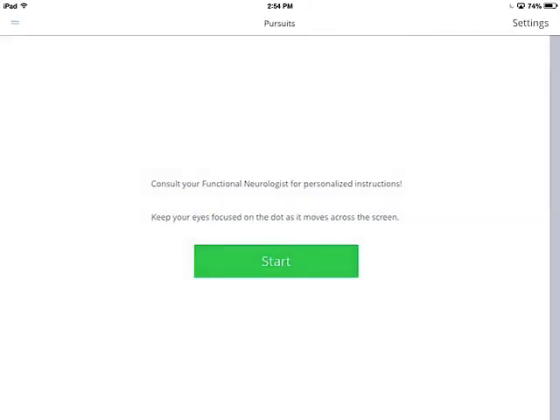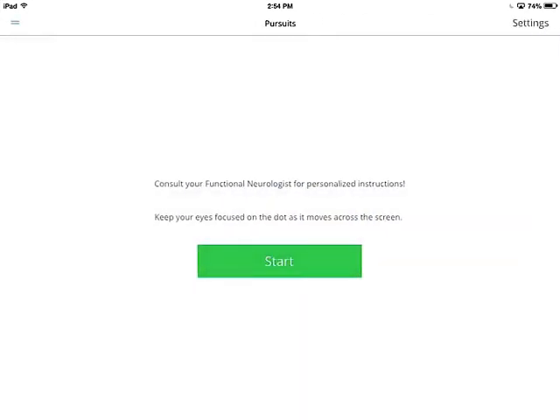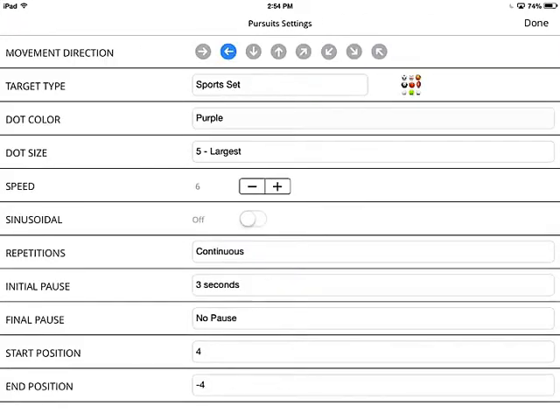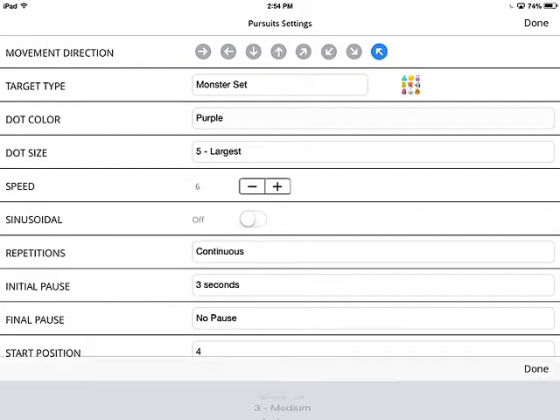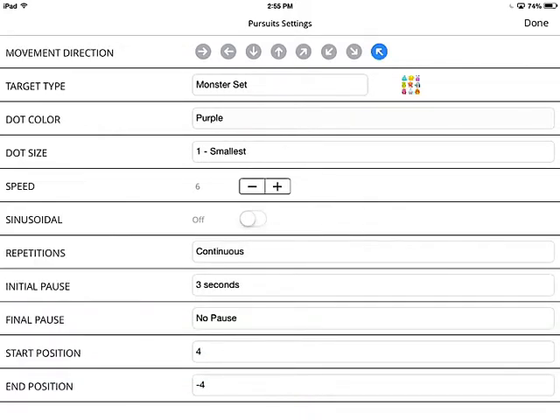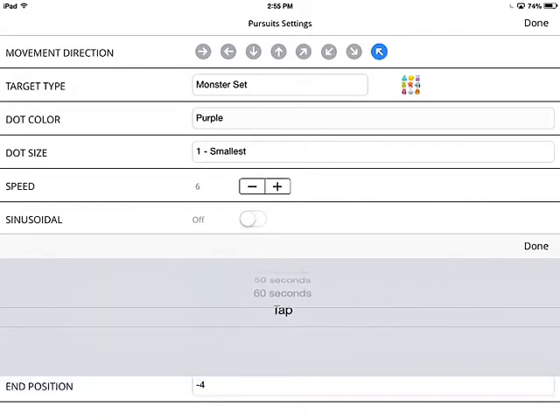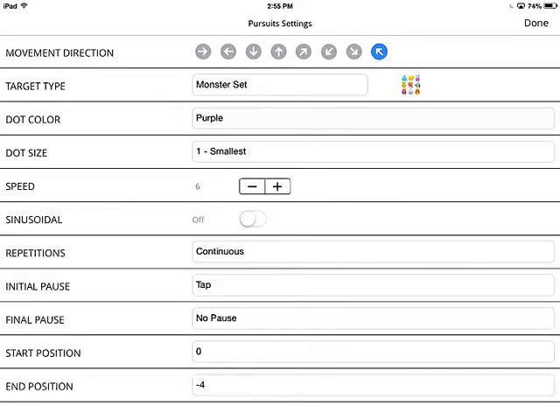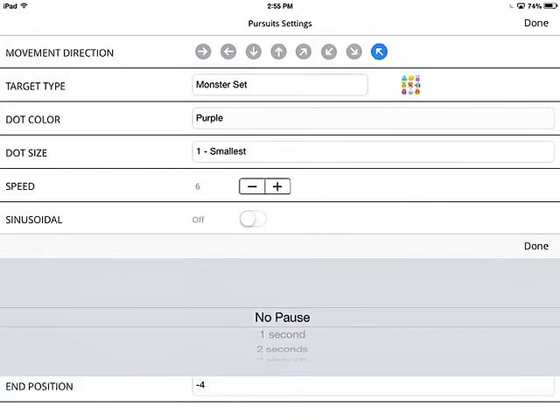Let's hit done and modify some settings to show how it changes. We can make it move from bottom right to top left, change the set to monster set, and make it the smallest size so you can see the extreme difference. This time I'll set the start position to zero so it starts right in the center of the screen, select tap for the initial pause so it won't start until I tap, and make it hold for two seconds at the end of movement.